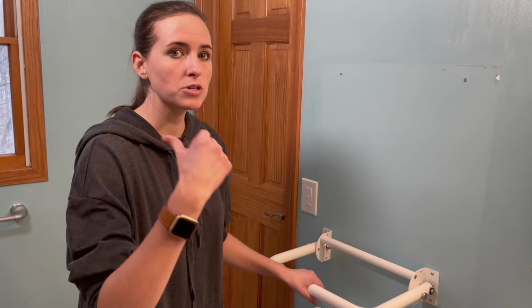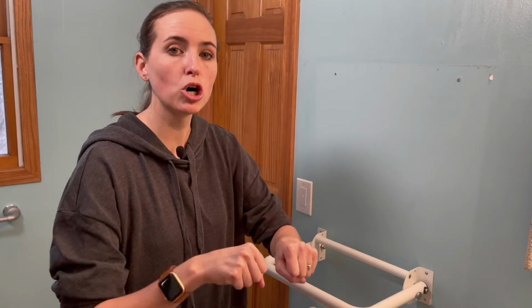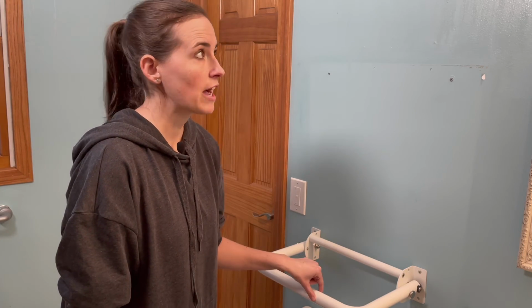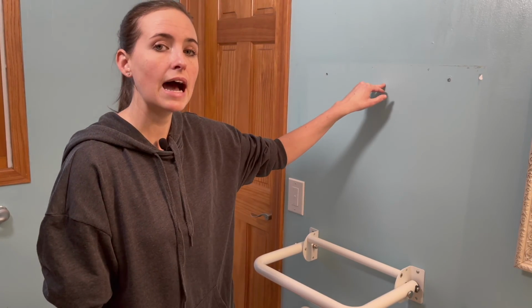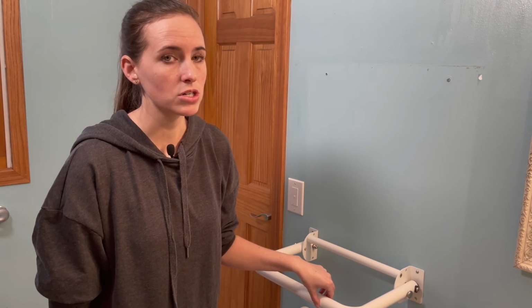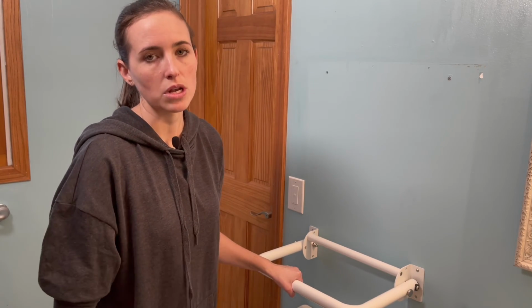It could also be mounted across from the toilet and used in a similar manner as something to pull on when coming to a stand, perhaps in a smaller bathroom where you have a wall directly across from you. Great option. The other option that the manufacturer suggests is mounting it slightly higher on the wall and using it as a stabilizing point for caregivers who are then holding on to it to allow them to help their loved one get up from the toilet.